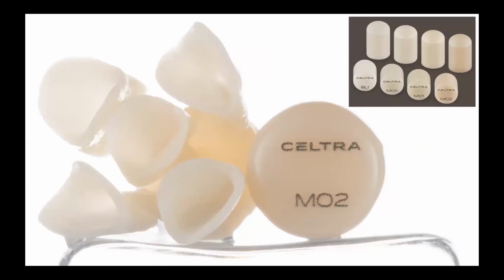And the last technique I would like to mention is the full customization with the help of veneering porcelain material. I know the dental technicians, my colleagues, like these techniques less and less because no one likes working hard. It's much easier to create the monolithic restoration according to the full shape of the tooth and finalize it with stains. But if we need to achieve the best aesthetics, and if we need to customize one single central, for example, or we need to mask the discoloration of a prepared tooth, this technique is still used.